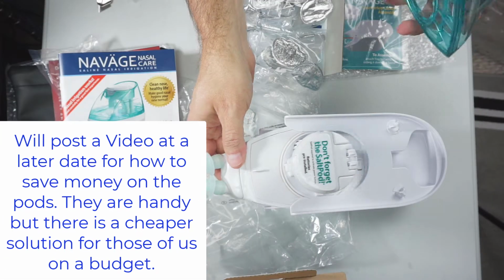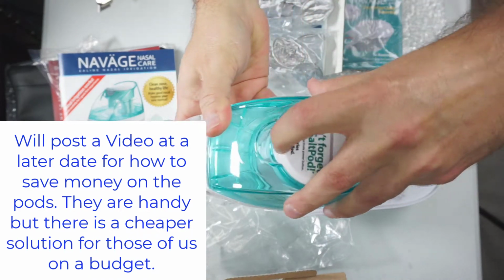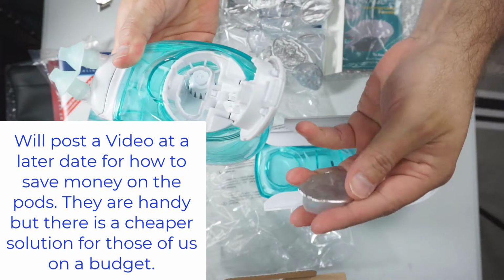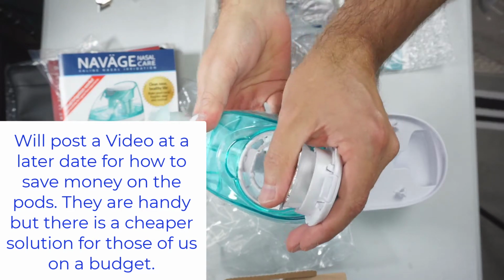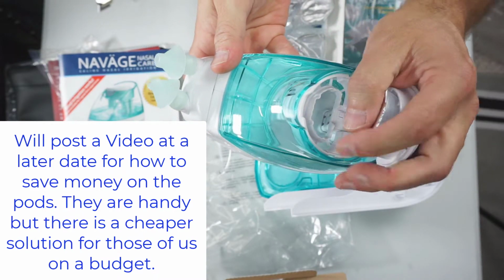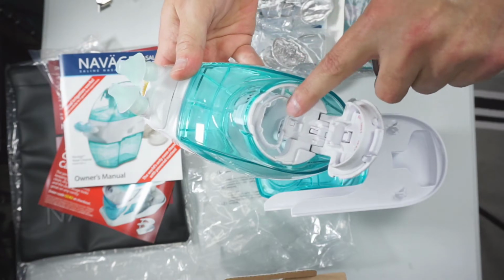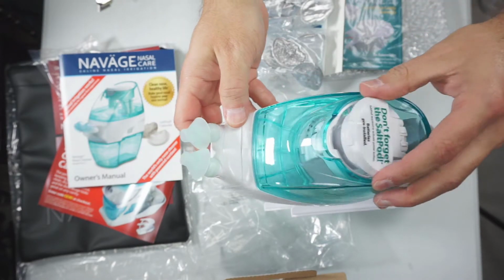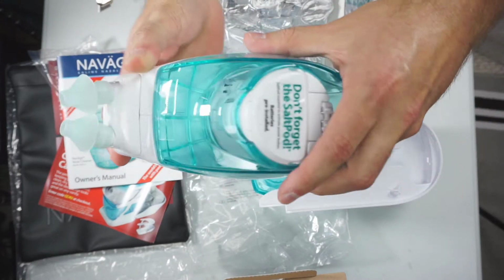So if this were assembled, put that sucker on there, and this opens, and then this wonderful pod you stick upside down, comme ça, okay? That goes in there to hold into place. Then you close it and crush it. And it crushes on, of course, these teeth. Now, since I haven't rinsed this out yet and everything else, I'm not going to do that at this point. I'm going to put it in. So you have to take off that top part.